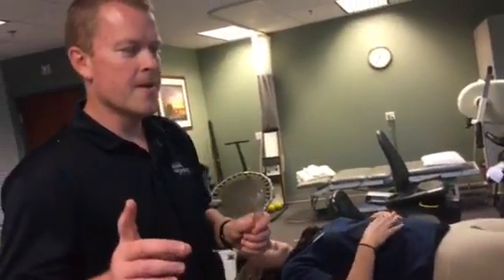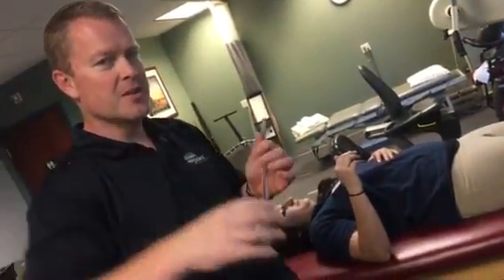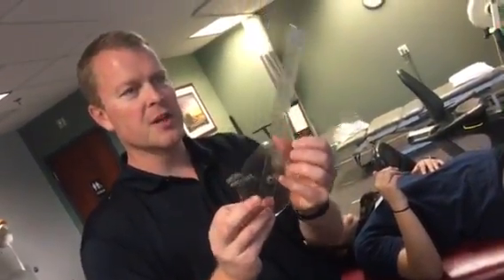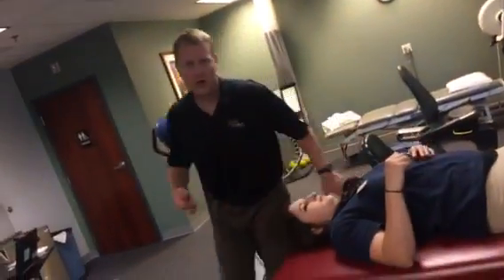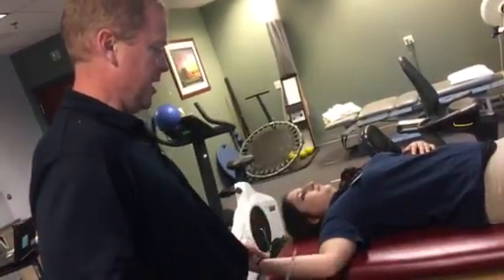I'm ready. Okay. So one of the things that we like to look at using math in our profession is movement. So we use what we call a goniometer, and it measures angles or degrees. One of the things that we'll look at is what we call the total arc of motion. Total arc of motion is the movement of external rotation here.